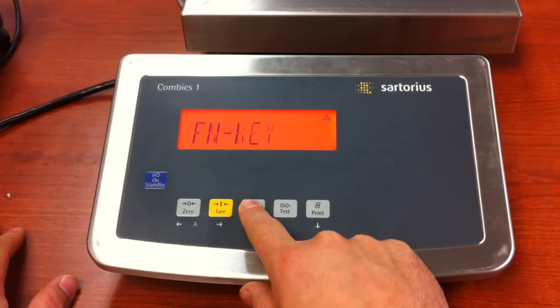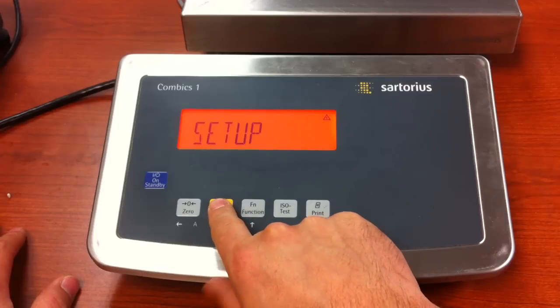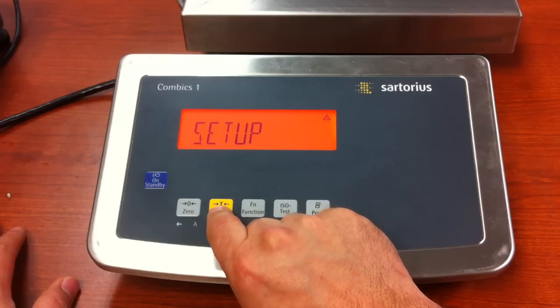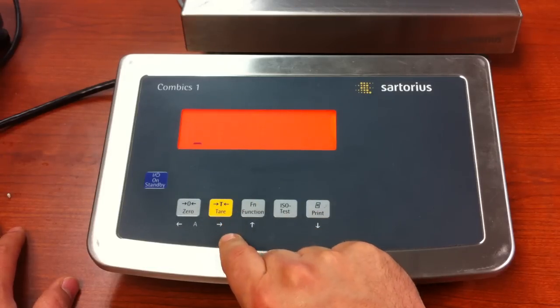At this point, press and release the function key until you get to setup. Now mine is locked, but more than likely yours will not be. So you do not need to input the service code, but on mine we will, because it is locked.